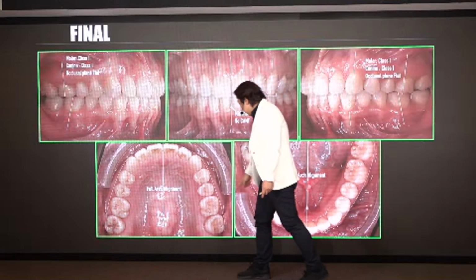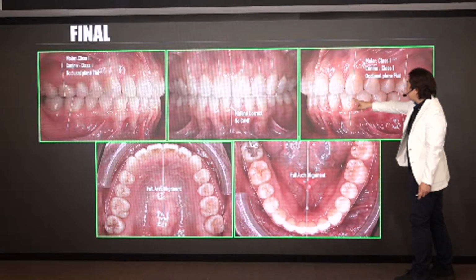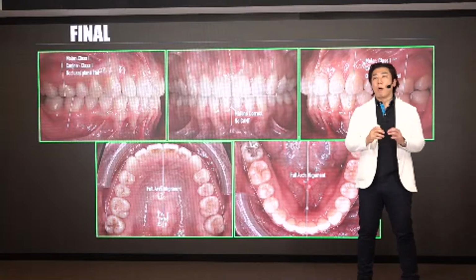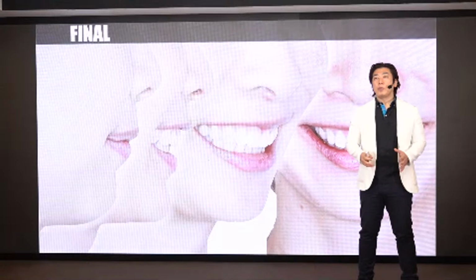This is the upper arch, lower arch. This is the left side. Canine guidance is class 1. Molar is a class 1 relationship. All the teeth are in perfect contact. This is the tooth position. The tooth position is good.